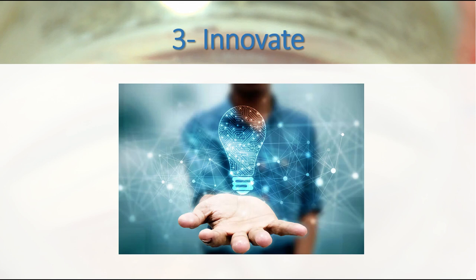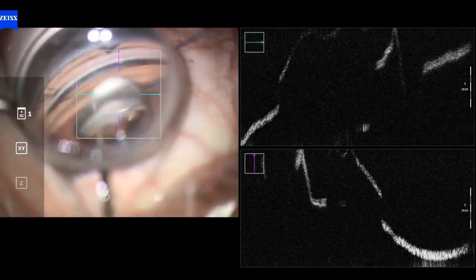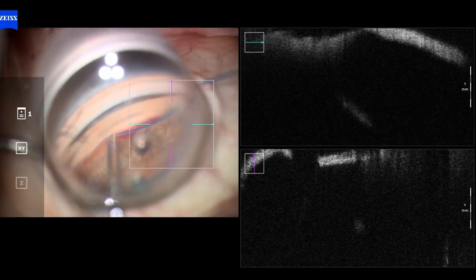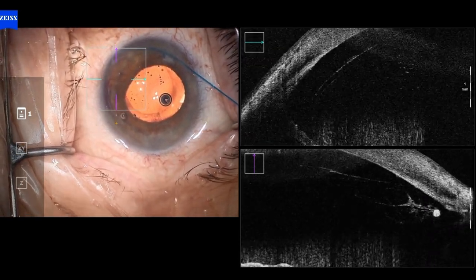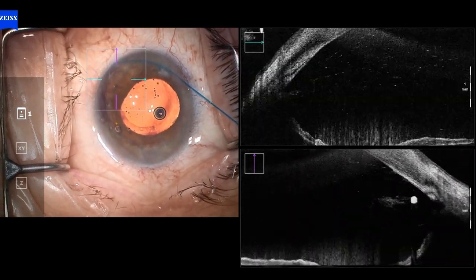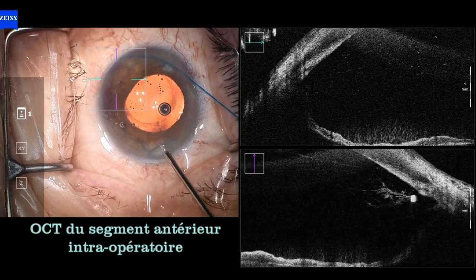After you're comfortable with the surgical GATT technique, you can start innovating. Here we can appreciate, thanks to the Artevo 800 and its intraoperative imaging, the detail of the Prolene suture during the trabeculotomy. And also after doing the trabeculotomy, we will be able to assess the suture. We see some blood. After removing the suture with the forceps, we can see some opening in the iridocorneal angle in Schlemm's Canal.